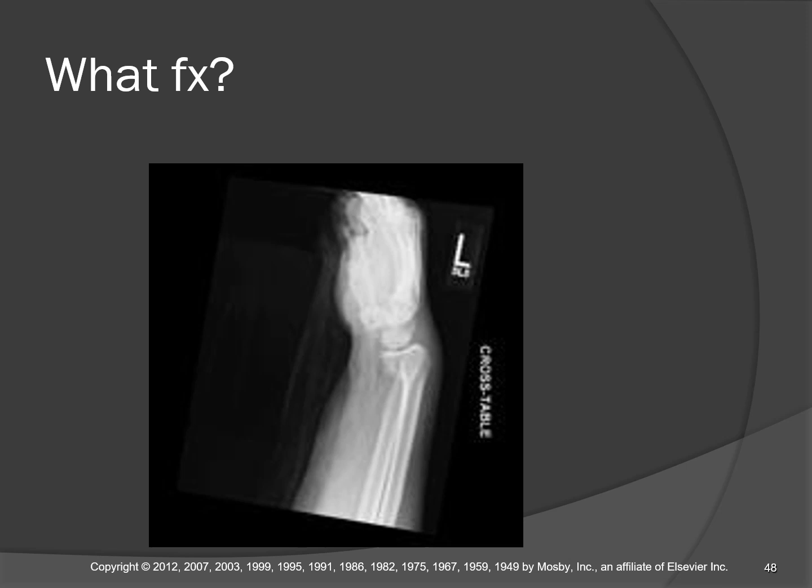What fracture is this? So this is a cross table, but we have a lateral. There is a transverse fracture of the radius, and the distal anatomy is anteriorly displaced this time. And so this is not a Colles, this is a reverse Colles, which is called a Smith's fracture. Okay, it's pretty good lateral for considering the patient's condition.